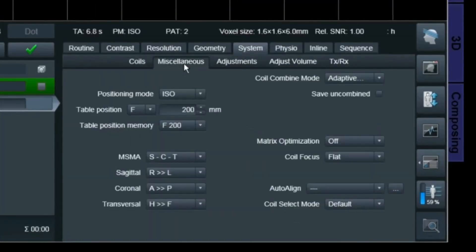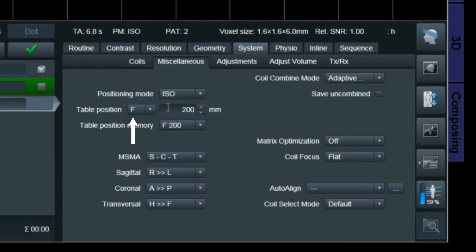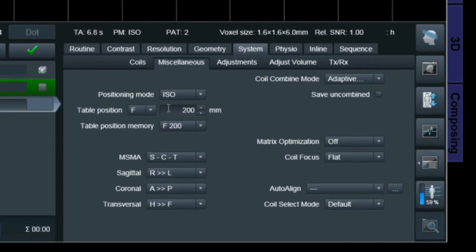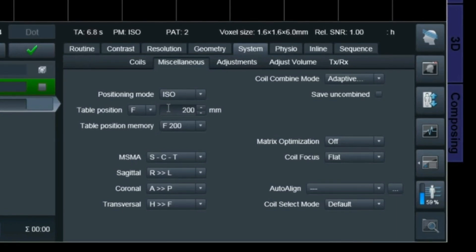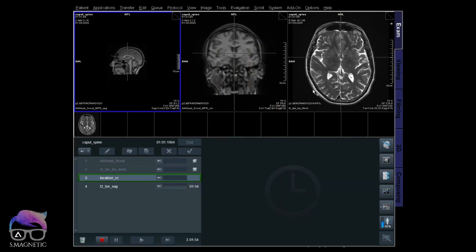If you want to combine the head and the spine, you can save the localizer for the spine with an offset of around 200mm toward feet direction. That means whenever you position the isocenter at the head and pull over this localizer, it will move downwards towards your feet 200 millimeters automatically. You don't have to manually move and position it every time.